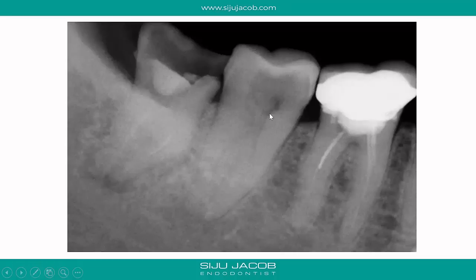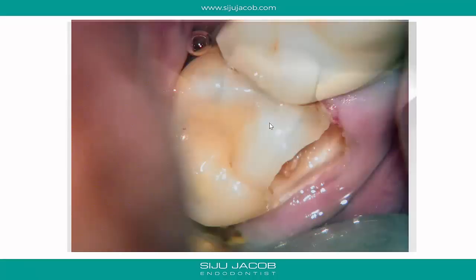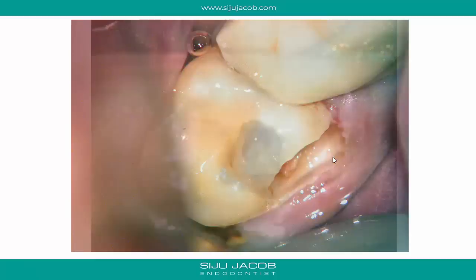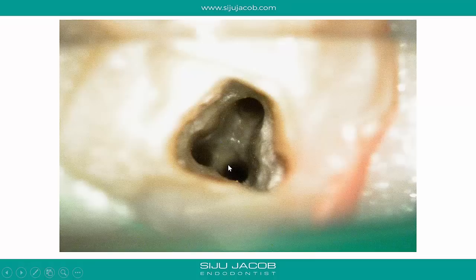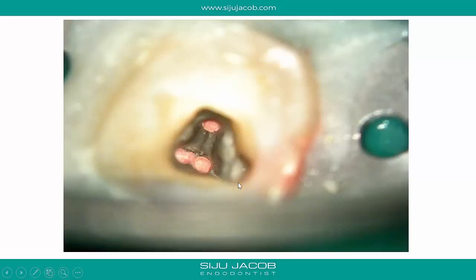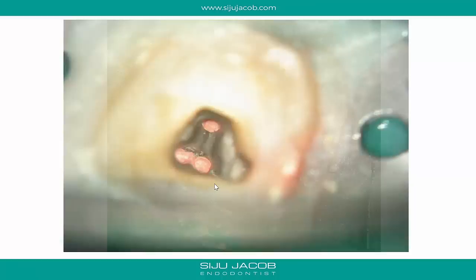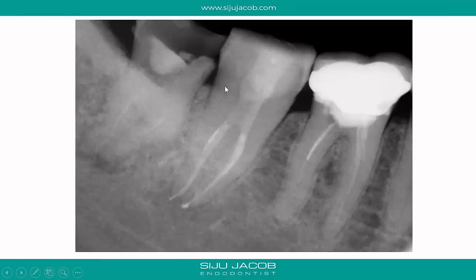This is another case with calcification all the way to the cervix — what appeared black was actually a cervical erosion, not the pulp chamber. We first patch that area and then make the access from the coronal direction. Under the microscope you can clearly differentiate the calcified portion of the pulp from the adjacent monochromatic dentine, allowing you to stay on target until you find the canals. You can see how conservative you can be with the microscope — achieving the desired goal without sacrificing too much coronal tooth structure.